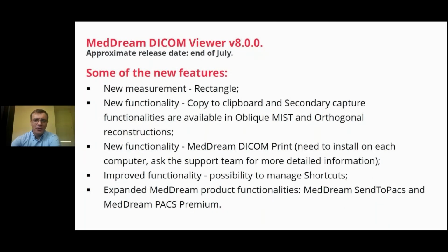As I have been working in this field for 20 years, every year I think that DICOM print is a function which is already dead. But each time our partners request it, not in all markets, of course, but still, as our technology is used in the most developed markets and also in emerging markets, we still face the problem that not in all countries do they even have computers.